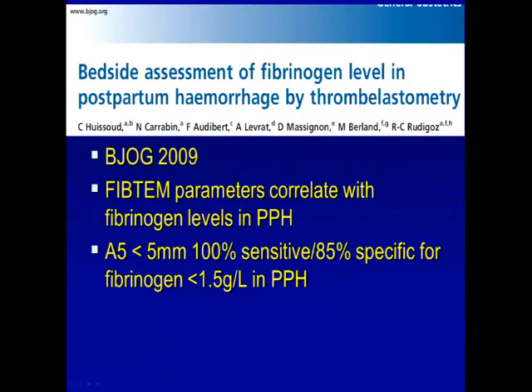Speaking of which, what did you find about ROTEM in the setting of the DOACs? You'll see it, but then it's not really correctable, right? Yeah, it depends which, with the newer reversal agents, which I think in a few years every single one will have. There are probably some case reports of people doing it on patients with DOACs, but there isn't any validation yet, so it's not really an accepted use of ROTEM. But obviously, when they do more studies, and there are reversal agents in the pipeline for most of the DOACs, ROTEM will probably be used as a monitoring or testing device in those studies, I would imagine. But right now, I don't think there's any data to suggest that ROTEM is better at picking up residual DOAC effects versus traditional coag testing.